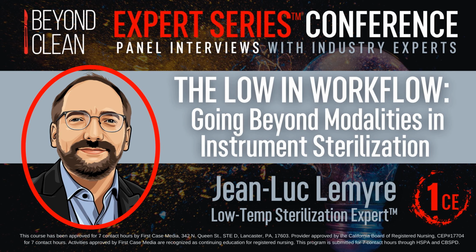It typically is always mixed with water in the way you would use it, either at home or in SPD. So for sterilization, it's very concentrated, 50 to 59%, but for just casual disinfection of surfaces, it's much less concentrated. The reason it works so well is that it's a very reactive molecule. So it oxidizes surfaces of microorganisms, and that's how it kills the bugs, basically. Because it's a very reactive molecule, though, it tends to degrade. So in the product that is sold commercially, there's typically some stabilizer to make sure it does not degrade on the shelf, and it's good up to its period of use. That's an important consideration for users to make sure that they follow the proper storage conditions, because if it's not properly stored, it will start to degrade in the bottle, and then you basically have just water left.